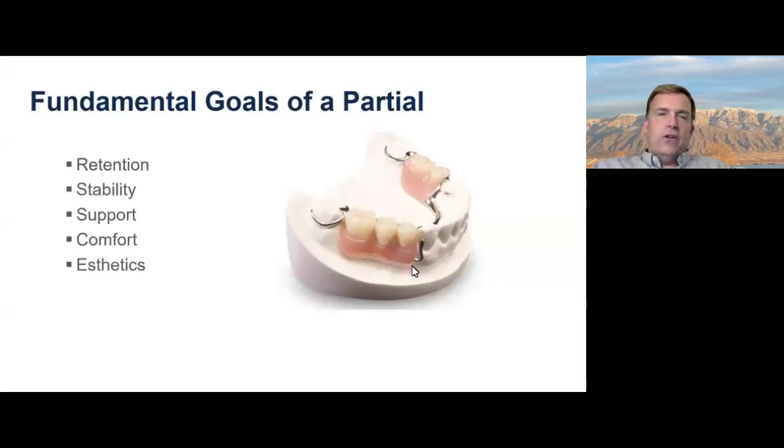And that transition line between the pink and the gingiva, and especially the little step, you might say, between the partial teeth and the natural teeth are sometimes going to be visible. We need to think about how that's going to look, try and show that to our patient, and make sure they understand that oftentimes there are some aesthetic trade-offs with partial dentures.